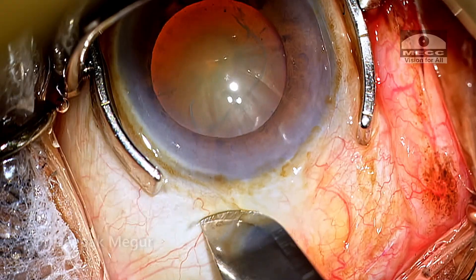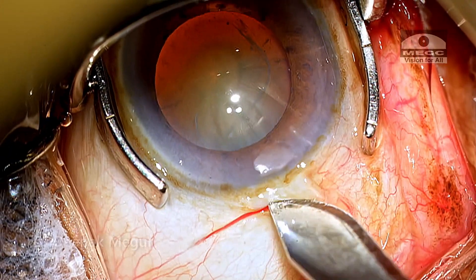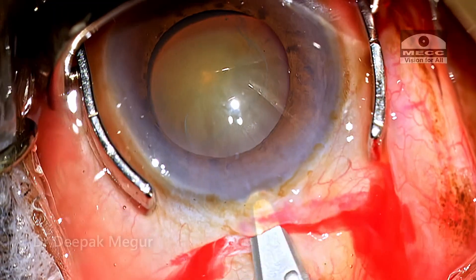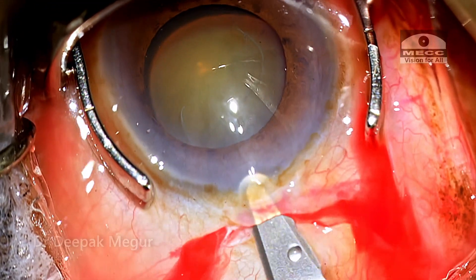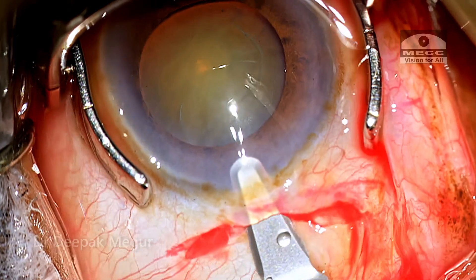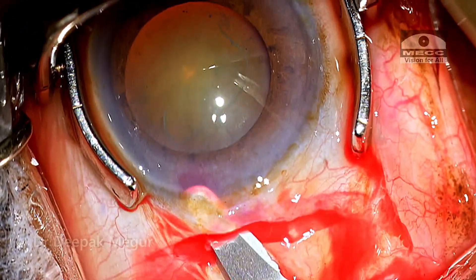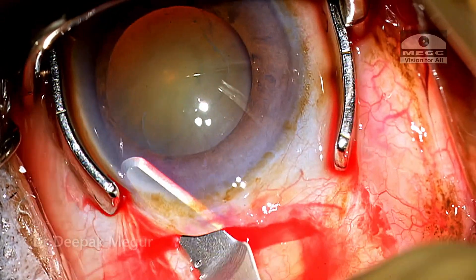It is placed about 1.5 mm behind the limbus and the globe is stabilized by a modified globe stabilizer. The tunneling is being done under the conjunctiva itself. There is going to be the issue of conjunctival bleed which is going to hamper the visualization.